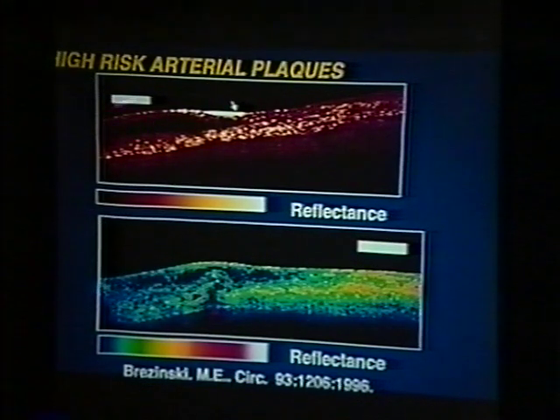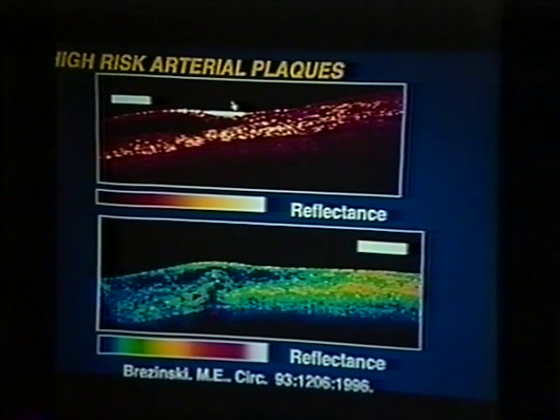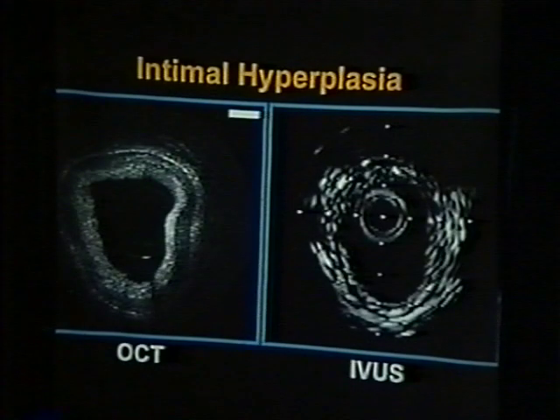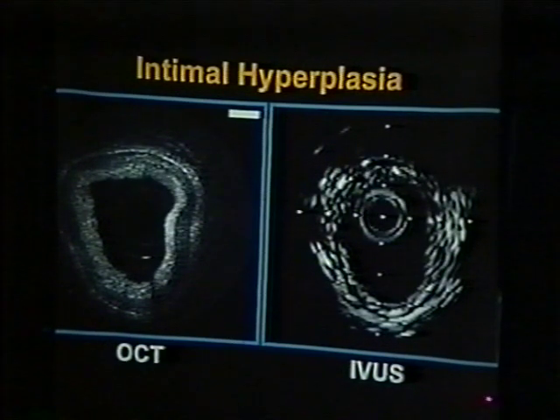I'm not going to go into great clinical detail, but I just wanted to show this one slide. This isn't from our group, it's from Rich Lee's group. But what we're looking at here basically is the likelihood of a plaque rupturing versus the intimal wall thickness. And it can be seen that when the intimal wall thickness, that's the cap over the fat, is less than 100 to 200 microns in diameter, the likelihood that this plaque will rupture and lead to a heart attack is much greater. When you think of this with respect to high-frequency ultrasound at 30 megahertz, which is the current clinical technology with the highest resolution, that's an axial resolution of 110 microns, or one pixel. Therefore, it suggests that high-frequency ultrasound will not be able to identify these lesions.